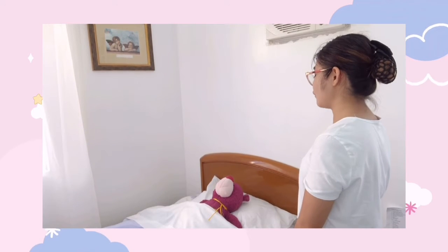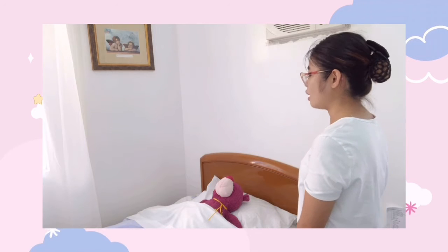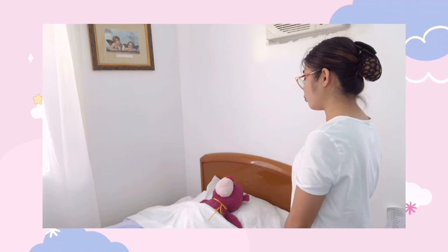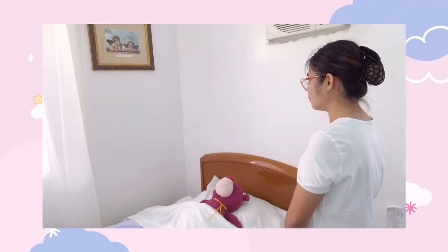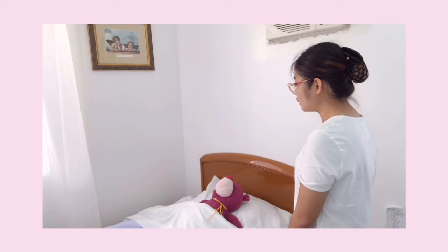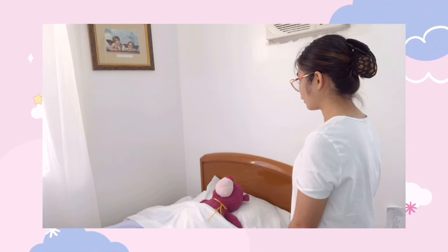My name is Danielle Villaseñor. I'm your student nurse from NUST. So, first one, may I know your name, please? My name is Kali Makaso. Okay po, Miss Kali. So, Miss Kali, ang gagawin ko po ngayon is papalitan ko po yung bed sheets nyo and yung puputi nyo. So, given your situation, medyo mahirap po para sa inyo tumayo tayo, saka habang inaayos ko po yung bed ninyo. So, gagawin po natin to habang nandiyan po kayo sa higaan. So, is that okay with you? Yes, okay lang naman. Okay po, ma'am.